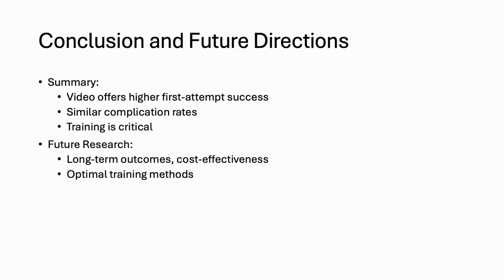Conclusion and future directions. To wrap up, video laryngoscopy boosts first attempt success, 85.1% versus 70.8% in the device trial, without increasing complications, making it a game changer for critically ill patients. But it's not a magic bullet. Training and experience drive its success. Mastering both keeps us versatile.